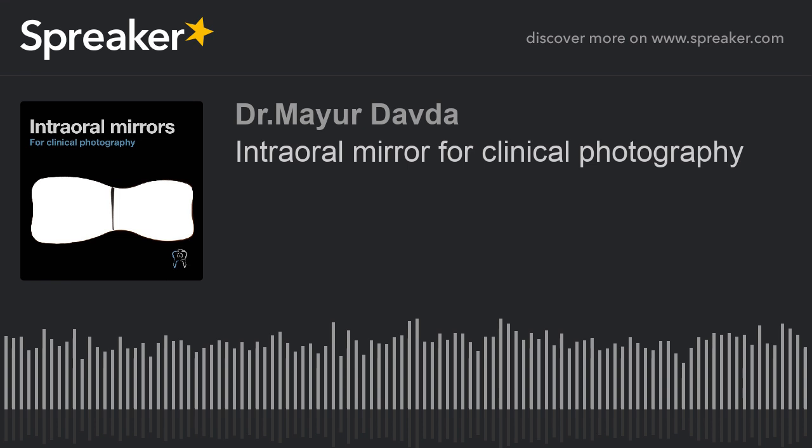I like to record images very quickly. So whenever I put the mirror inside the patient's mouth, I just request the patient to stop breathing for 2 to 3 seconds, and that would be it. If you follow the workflow properly, you require not more than 5 seconds to record a particular image, and it's very comfortable for the patient to not breathe for 5 seconds. But this is not a good technique if you're a beginner, because you might take a very long time and the patient cannot hold his or her breath for a very long time.